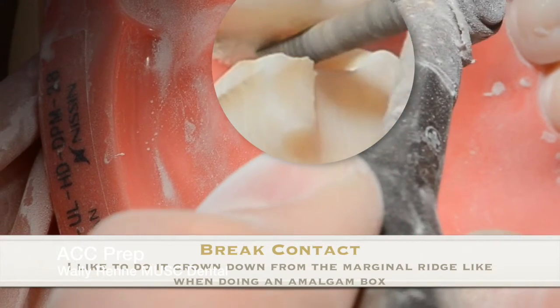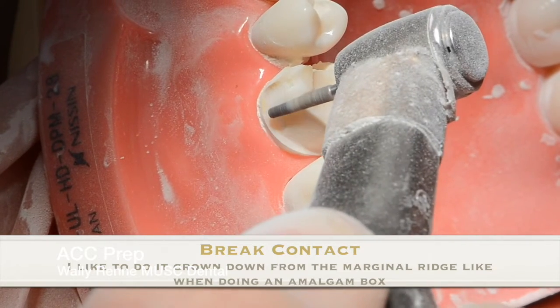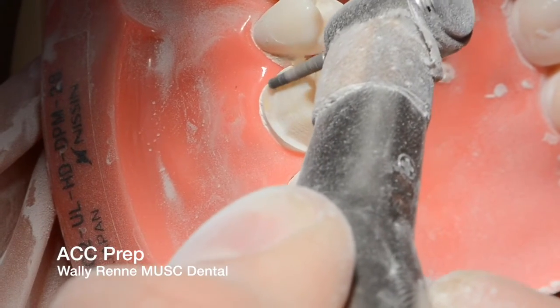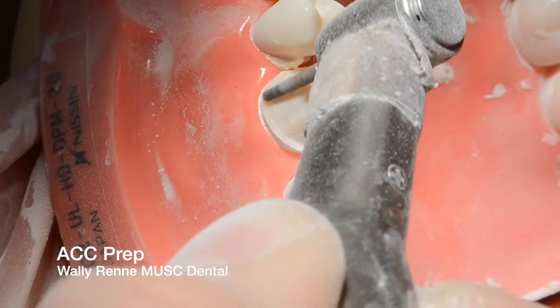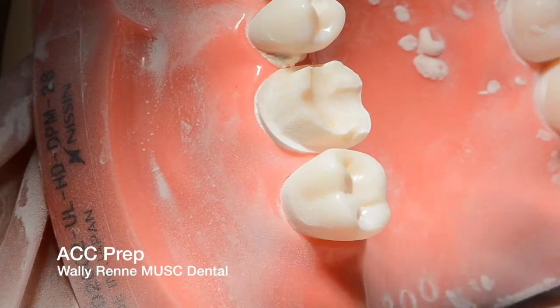This will help you with the skill of using your mirror and direct visualization depending on whether you're maxillary or mandibular. Now that you've got that broken, you can take that facial shoulder — which is roughly around 0.8 millimeters because you're using the tip of that diamond and no more — and blend it in with that interproximal separation that you just did from the crown-down method.